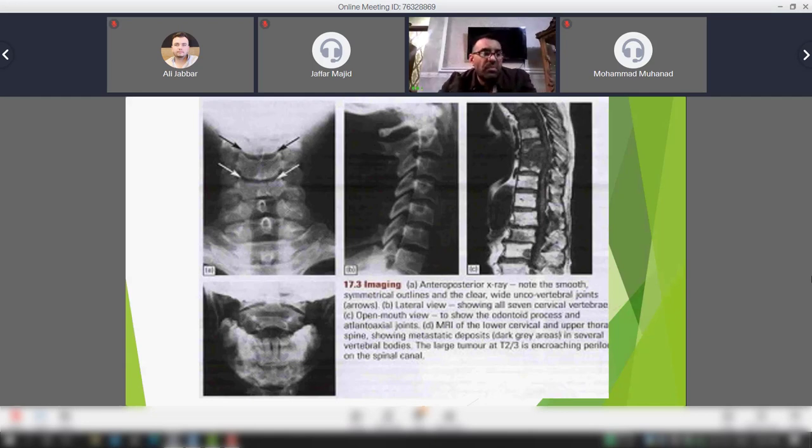That is for the lateral view. The AP view, plain X-ray of the cervical spine AP or PA view, shows the articulation of the spinous processes of the cervical spine over each other. See the spinous process centralized and the lateral recesses. We also have MRI, which is excellent for showing abnormalities. And we have the open mouth view for the atlanto-axial articulation, the fourth picture. The patient opens the mouth wide so you can see the atlanto-axial articulation of the axis over the atlas.